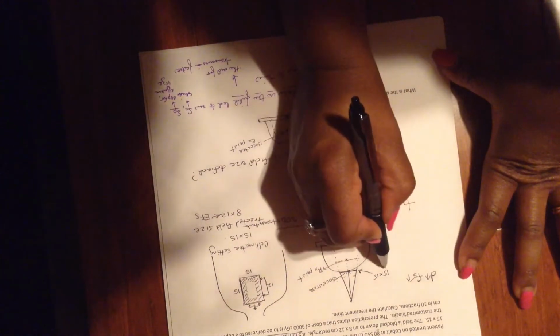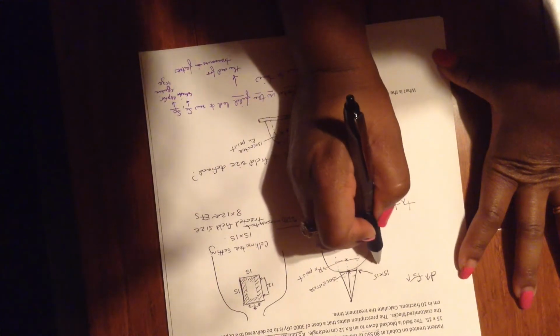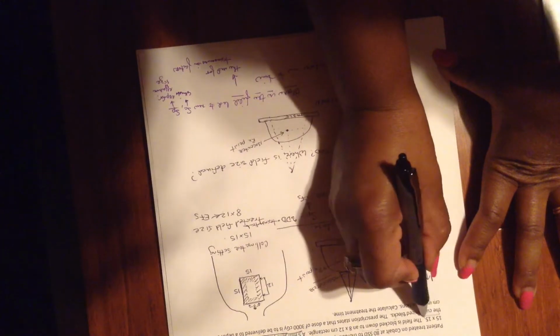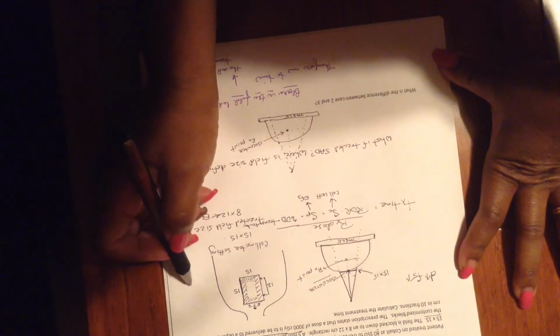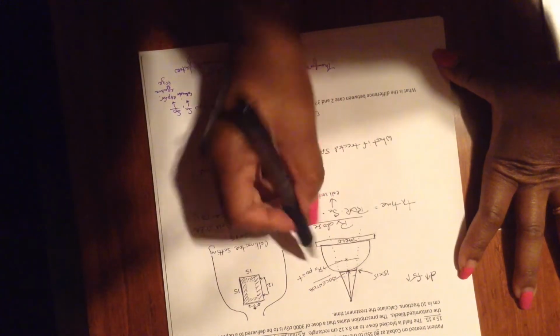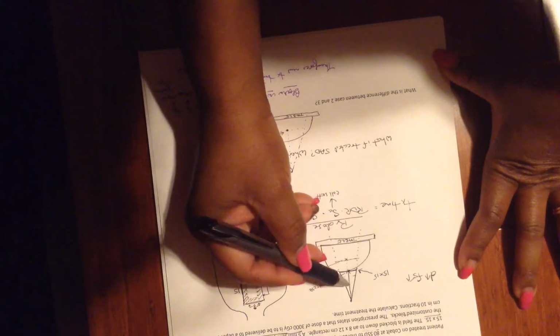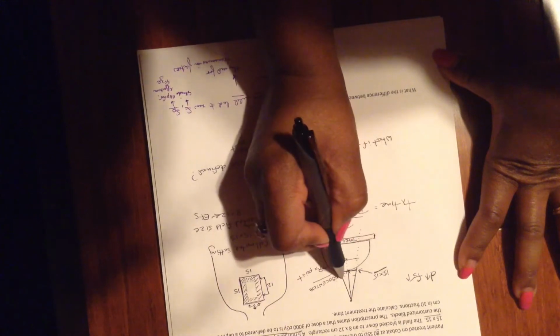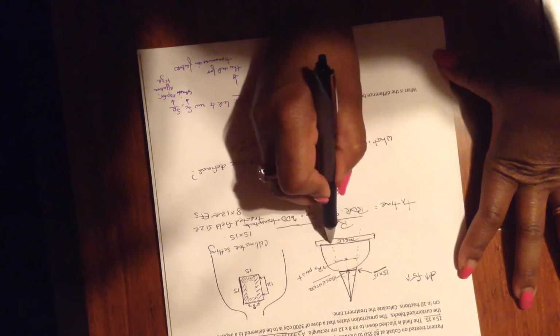The other important thing to remember is field size is defined at isocenter only. So wherever the isocenter is, that's where the field size expressed by X by Y is defined. Any other places away from isocenter, this field area would not be the same. It'd be something different. Smaller here, larger here, and even larger back here.